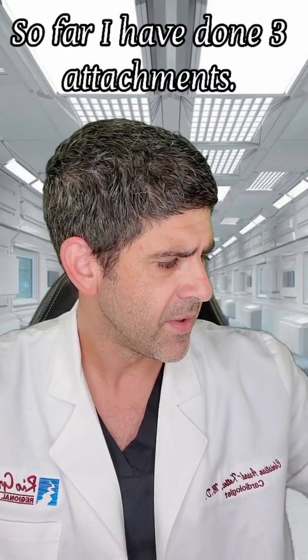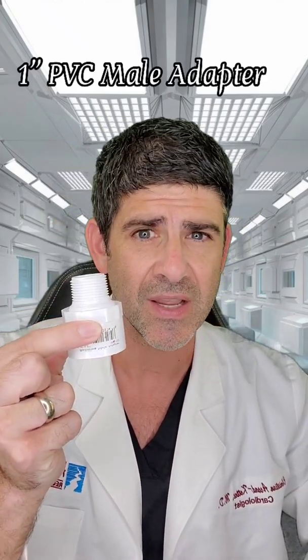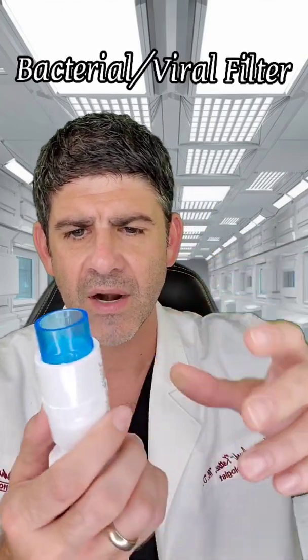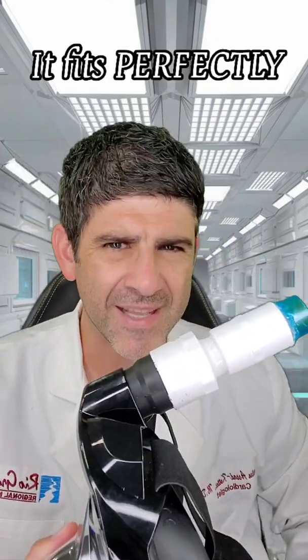This is basically just a one-inch PVC male adapter with a three-fourths female adapter. I screwed it together, then you get the viral bacterial filter, put it there — fits perfectly — and then I used some epoxy glue, and boom, fits perfectly.